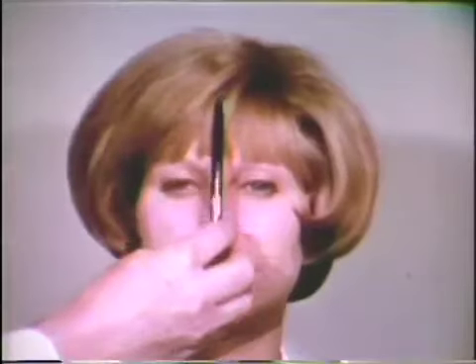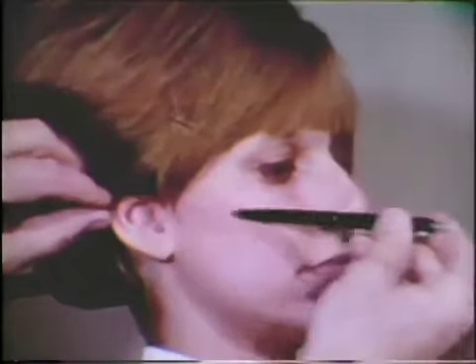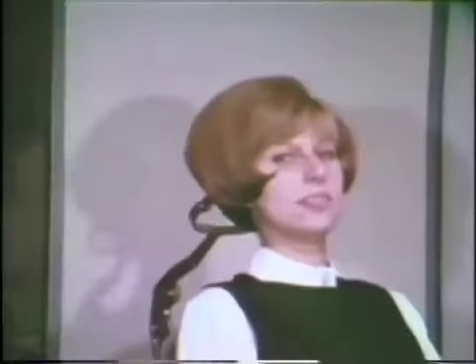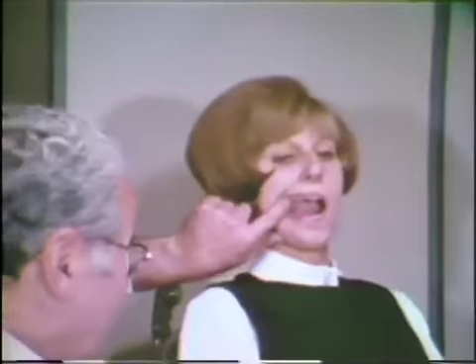The patient's head must be positioned so that the mid-sagittal plane is vertical. In a profile view, the line from the ala of the nose to the tragus of the ear should be horizontal. The occlusal plane of the teeth will then also be horizontal. The line of sight is a distinct aid in directing the X-ray beam.